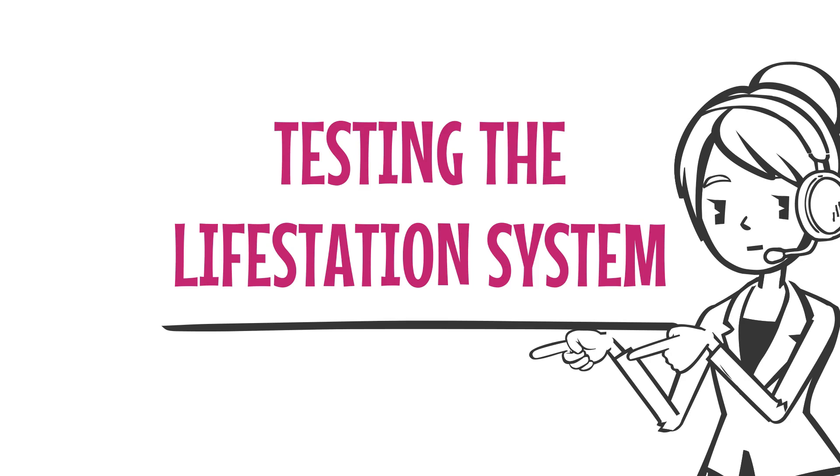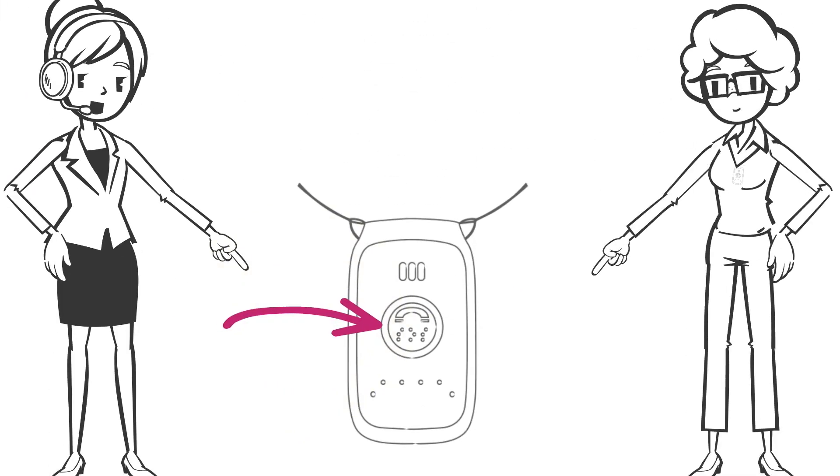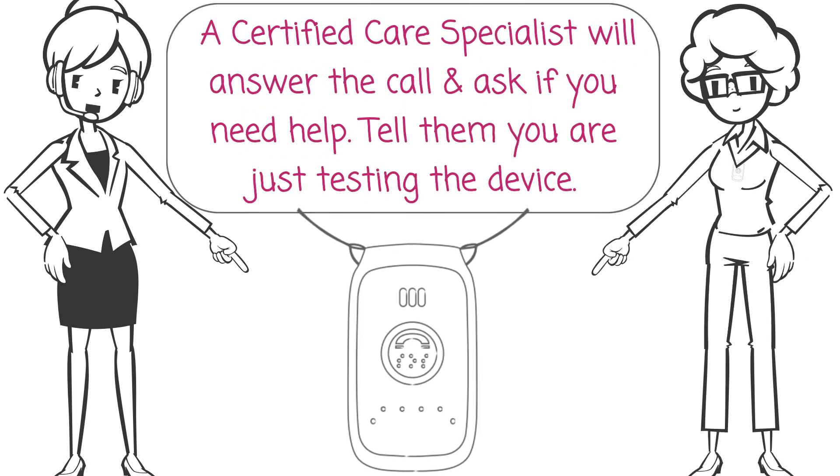Now your Life Station system should be set up and we can begin testing the system. Press and hold your help button until you hear the alert tones. A certified care specialist will answer the call and ask you if you need help — tell them you're just testing the device.